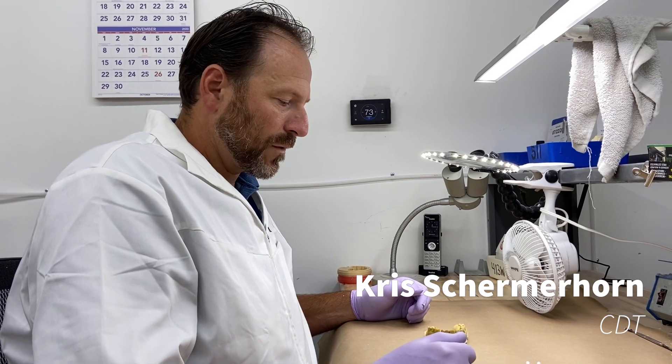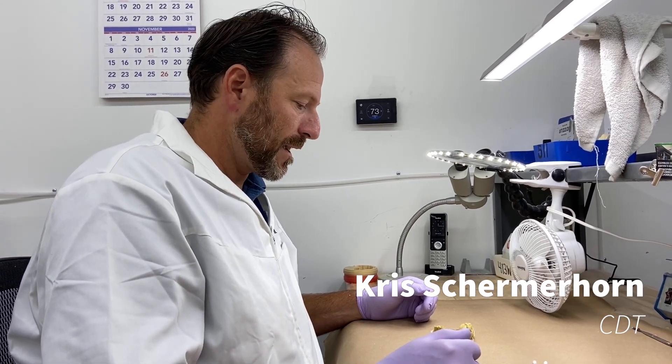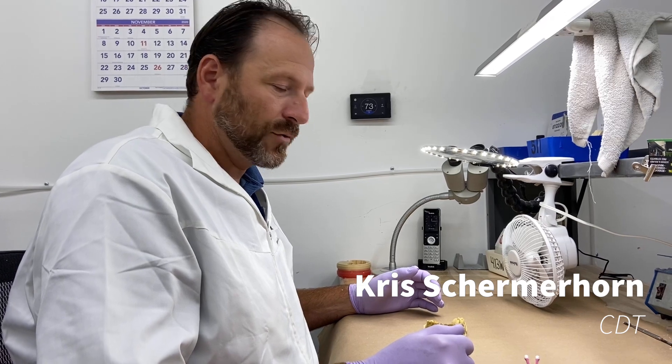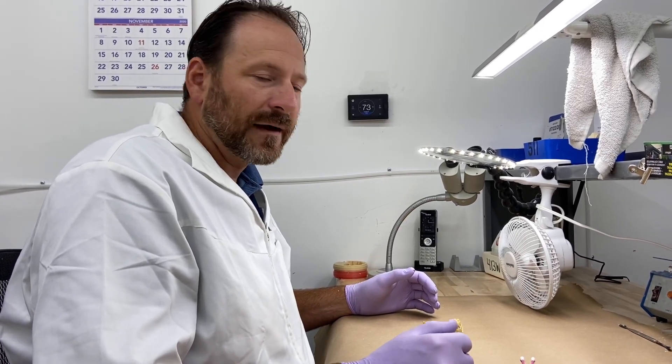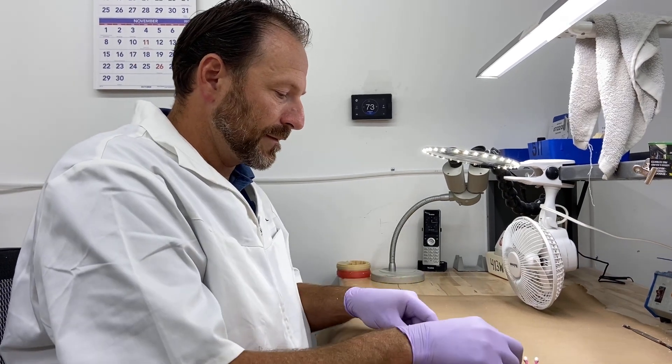Hey guys, this is Chris Schermelhorn with Meyerson. Today we're going to talk about luting a milled tooth to a milled DuraFlex base, having a socket that it sits in.